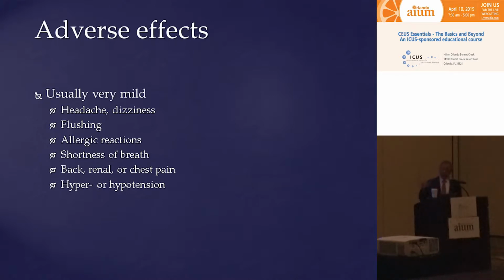Some patients complain of a metal taste in their mouth when we inject. I think it's just from the saline flush that we use to follow our bolus injection. In the 15 or 18 years I've been doing this, I had 2 patients who developed renal pain or back pain. It's a very short-lived complication or adverse reaction of contrast injection. There is something with bradykinins releasing from the renal cortex when you inject lipid-based microbubbles. All of those back pains or renal pains go away in about 1 to 2 minutes.